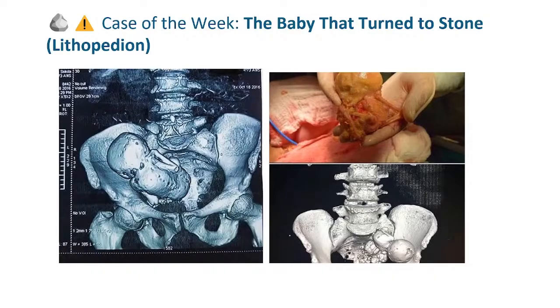At first glance, this patient simply presented with chronic abdominal discomfort and a pelvic mass. However, as the ultrasound probe was placed on the abdomen, an astonishing picture appeared. What initially seemed to be a calcified mass slowly revealed recognizable fetal bones, including the spine and long bones. The ultrasound findings immediately raised one of the most extraordinary differential diagnoses.